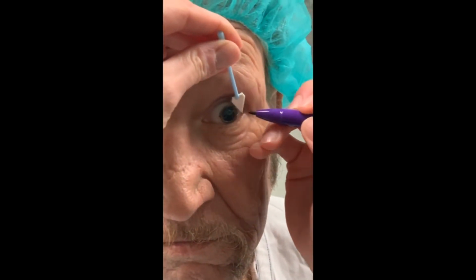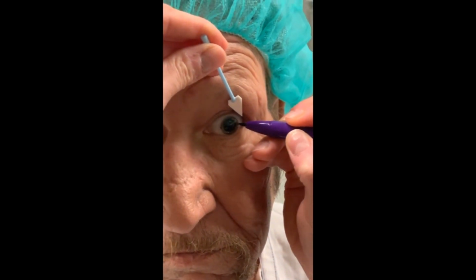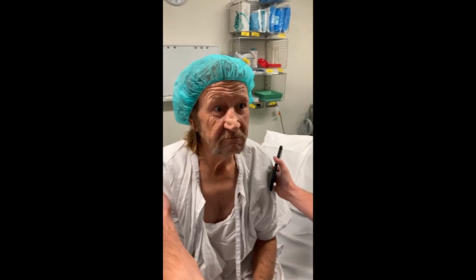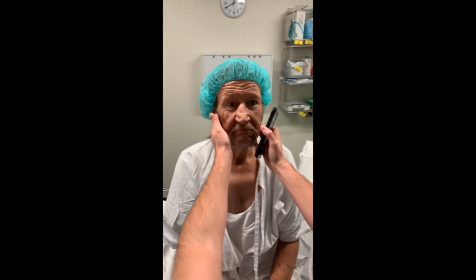And keep looking at her finger. Well done. Lower over your brow there. And I'm just going to check where those marks are. Yeah. So sit up really nice and straight, Eric. That's great. That's brilliant. Okay.